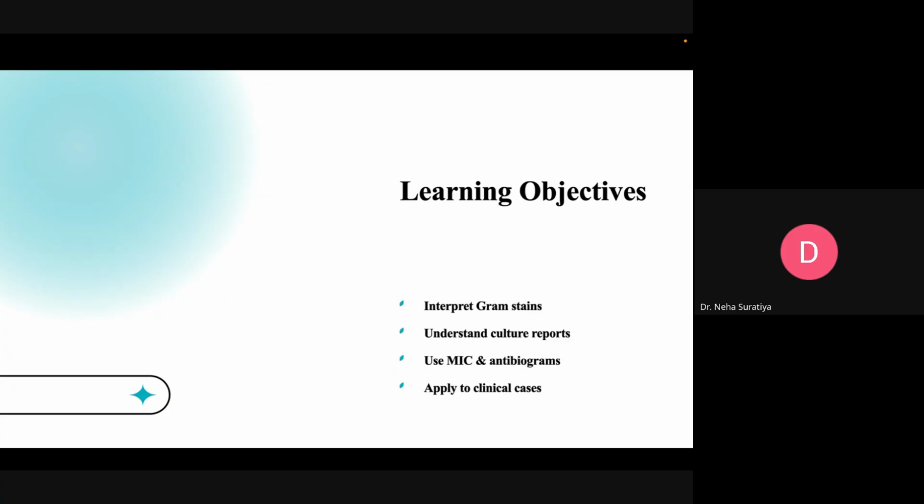Okay, and the lab report also has the MIC value, that is minimum inhibitory concentration, the lowest possible drug dose which can be useful to kill the bacterial growth, so that you can obviously avoid toxicity, right? So these are all the things mentioned in the report.